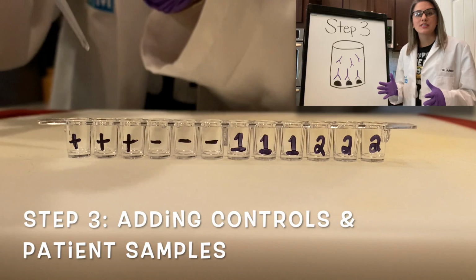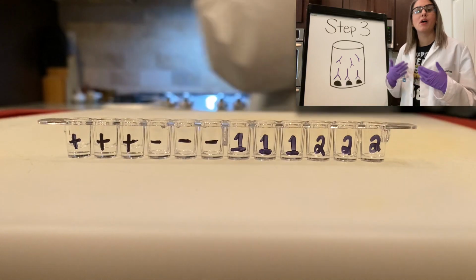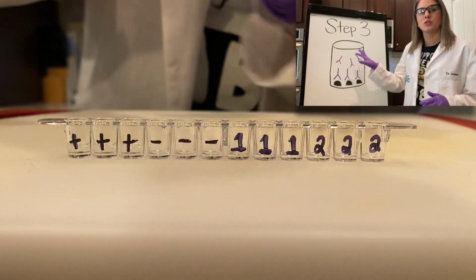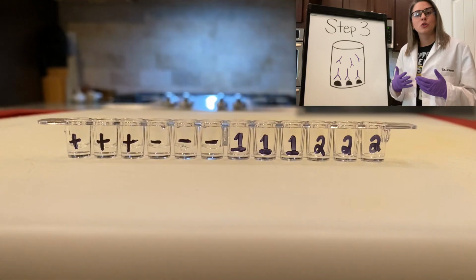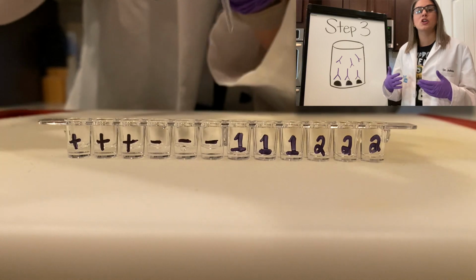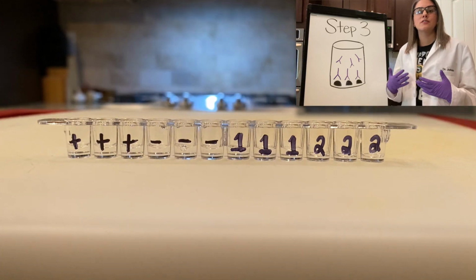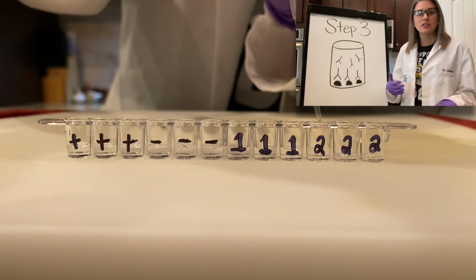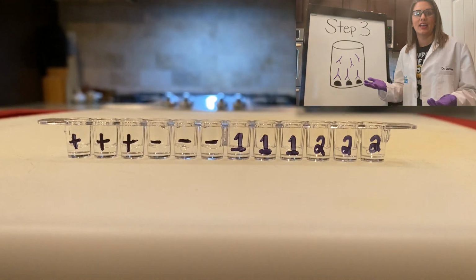Now it's time to add our samples. In our positive wells, we're purposefully adding in those antibodies because we want a positive test result. In our negative wells, we're purposefully leaving these antibodies out, so there won't be any antibodies present because we want a negative test result. Controls help us do 2 things. 1, they let us know that the test is working properly because we know what the expected result should be for those test samples. 2, it also gives us a visual of what a positive or negative test result should look like, because when we add in our patient sample, we don't know the outcome. We're only going to be able to determine that once we get to the very end.